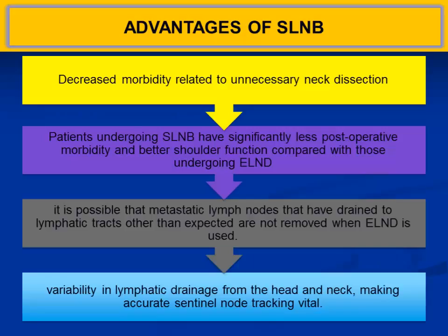Advantages of sentinel lymph node biopsy: it reduces the morbidity related to unnecessary neck surgery. Patients undergoing sentinel lymph node biopsy have significantly fewer postoperative complications, and variability in lymphatic channels has to be taken into consideration. So, by doing SPECT CT or dynamic imaging, you can assess the expected pathways of sentinel node mapping.